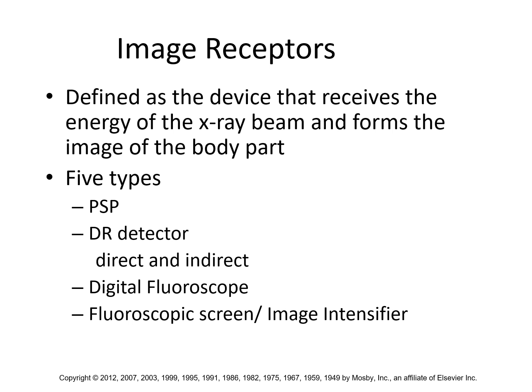That came onto the marketplace just as I was becoming an X-ray tech. I became an X-ray tech in 1998. So mid 90s to late 90s, that's when PSPs became widespread use. I think the first iteration was actually debuted in the early 90s or late 80s, but it didn't get adopted widespread by hospitals.